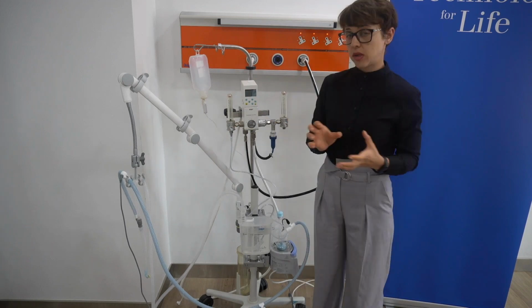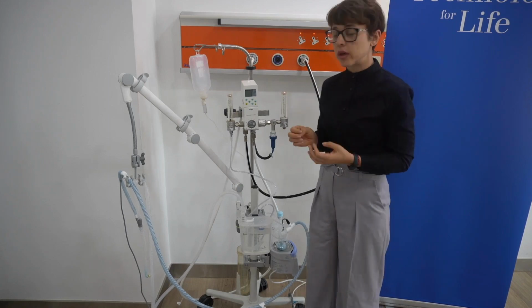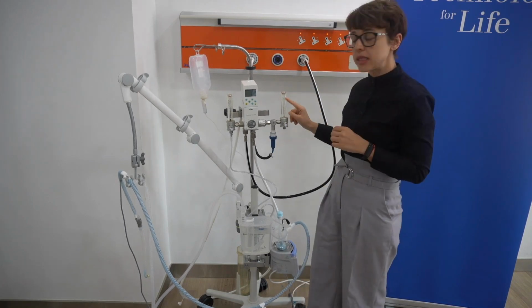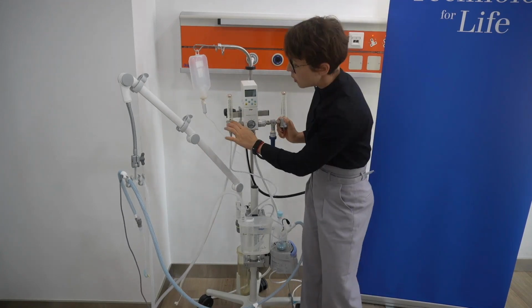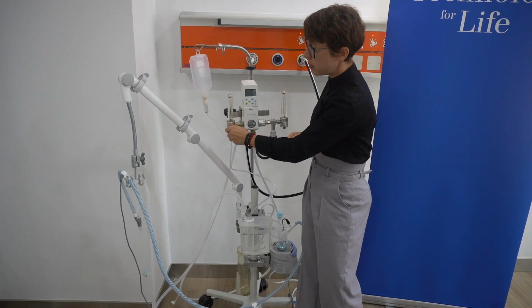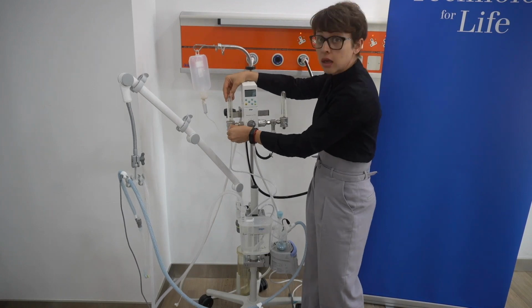Also we have 2 flow meters here. We also have the possibility to have just 1 flow meter, depending on what kind of flows you are used to working with. We have the low flow meter, which goes 0 to 3 liters per minute, and then we have the higher flow meter, which goes from 0 to 15 liters per minute. And obviously you have the control knob that helps us set the right flow. We can increase the flow by turning the rotary knob.